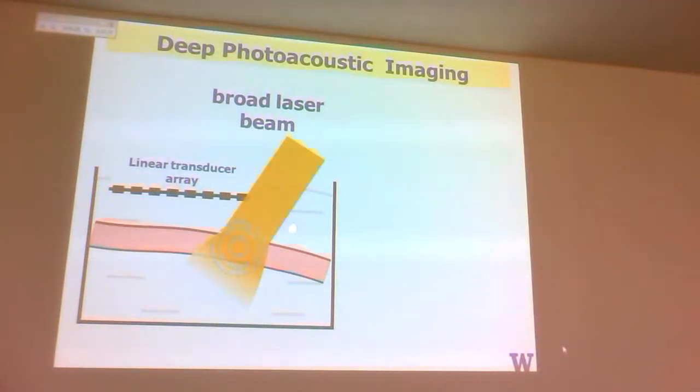The broad, high-pulse-energy illumination is optimum, always will be optimum, but it forces these very low rep rates. And you're not going to be able to take advantage of all the spatial frequencies because of these limited arrays. But anyway, the first systems were done this way: just take a linear array, take a big pulsed laser, and see what you can do.